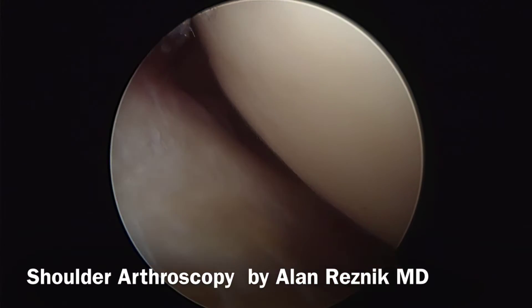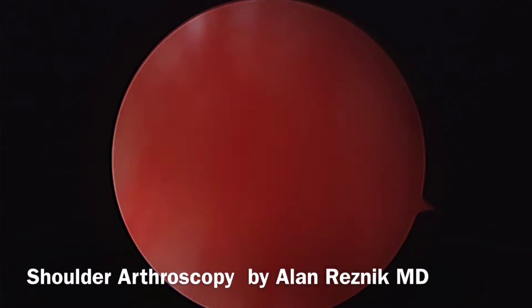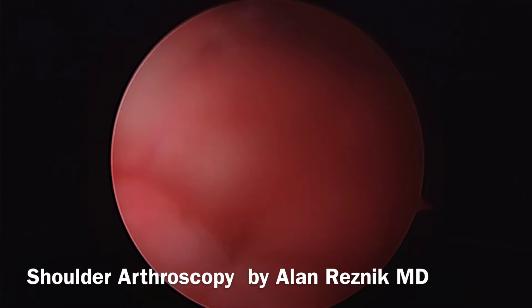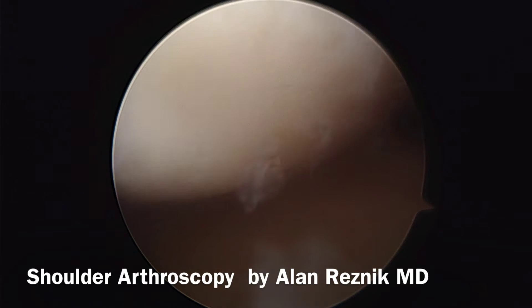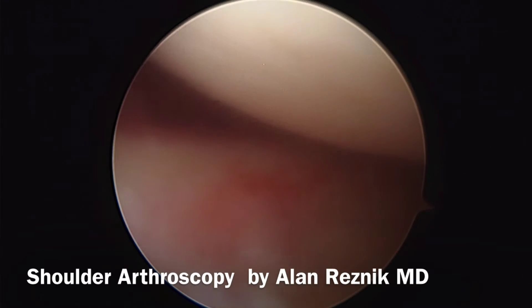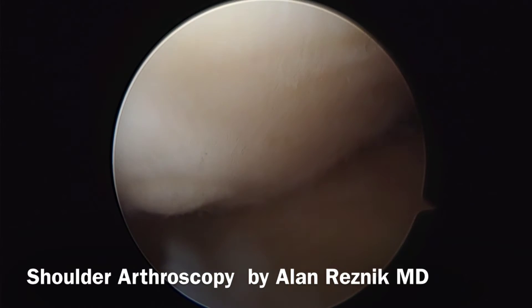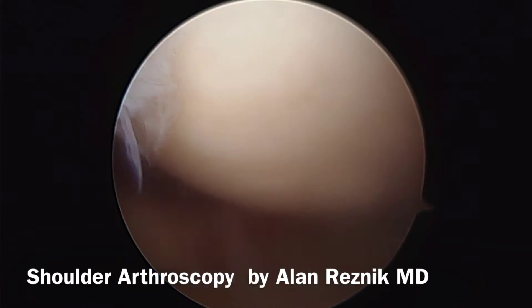Looking superiorly anteriorly, there's a little inflammation there as well. The glenohumeral ligaments are a little bit inflamed. She does have a slightly positive drive-through sign, so she is a little bit laxed, but she does not have a tear. She subluxes a little bit but doesn't fully sublux.